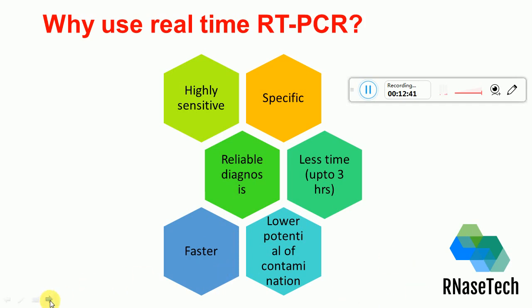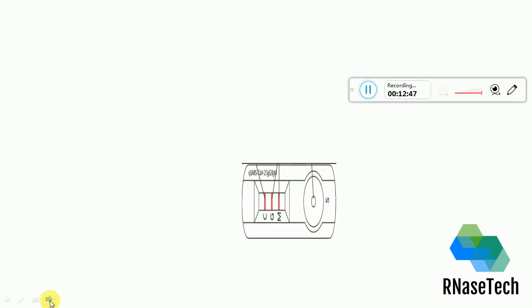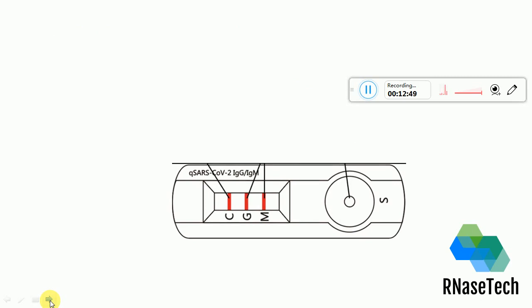Okay. So now, moving forward, I will explain what the antibody-based diagnostic kit is. Basically, this is the diagram of an antibody-based kit. As you can see here, this is the process. This is the portion of the strip, like a pregnancy test kit. Here we can drop the sample, a blood sample or any sample. Normally we use a blood sample for this.